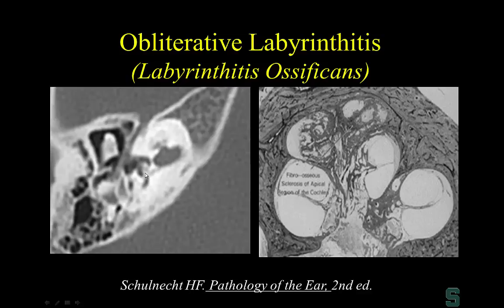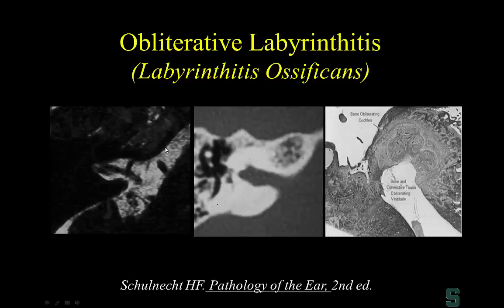The vestibule should have the same attenuation as the IAC, but it too can be replaced with increased attenuation in labyrinthitis ossificans. The most common location to look first is the basal turn of the cochlea. If untreated, it can involve the middle and apical turns as well. This is an example of very severe labyrinthitis ossificans with complete replacement of the cochlea and vestibule — no fluid visible on heavily T2-weighted images.